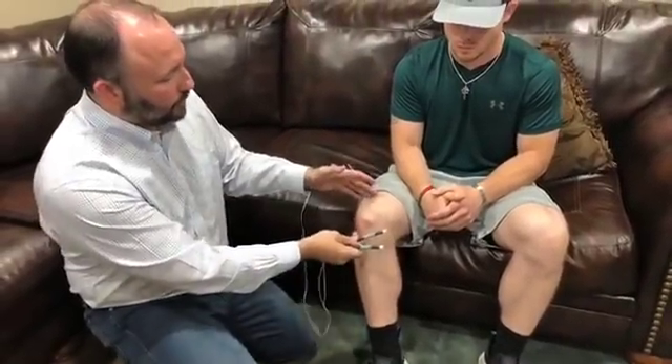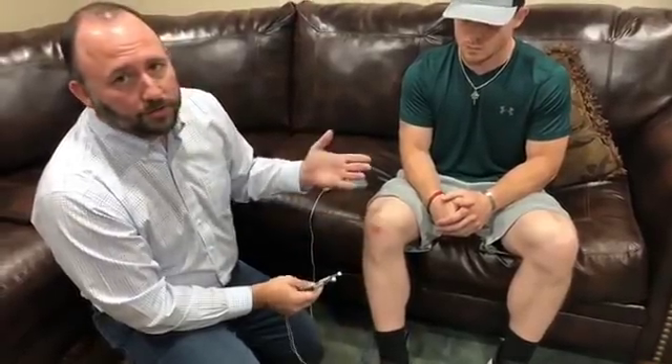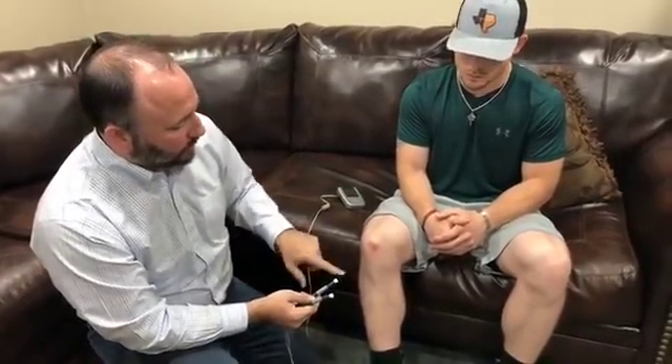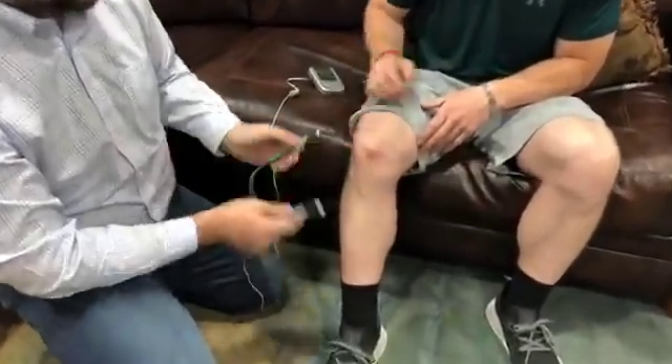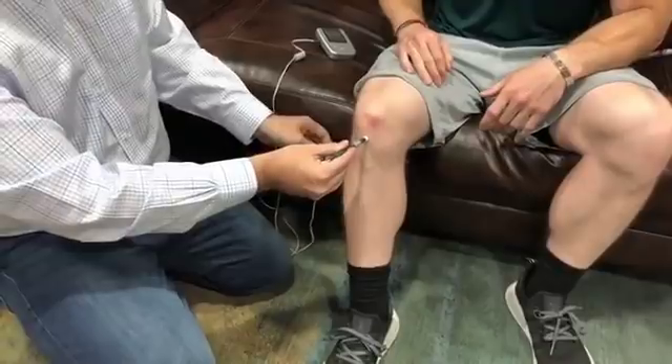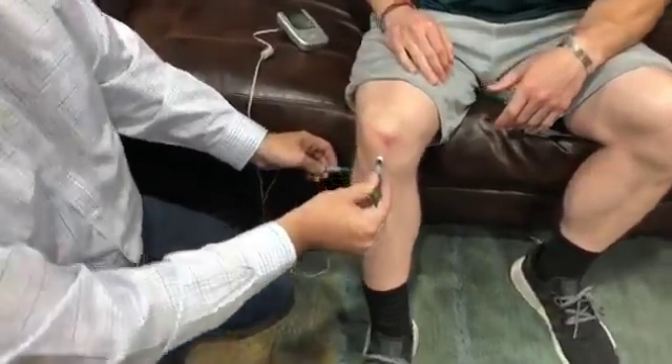We've gone through our basic two-minute protocol — we did our big X, small star, treat the opposite sides, and then connected the two sides. That would be our initial setup. The first thing we would have done was ask Travis his pain zero to 10. Let's say hypothetically he had a 6 out of 10. We do our two minutes and maybe he's down to a 3 or 4 — so it's improved a little but we're not completely done. The next step would be to ask him to put one finger on the worst location of pain.